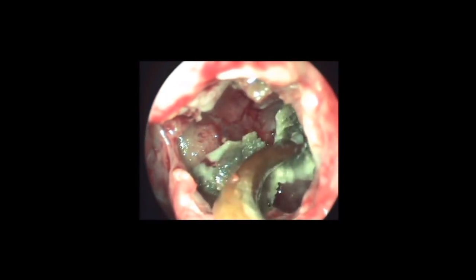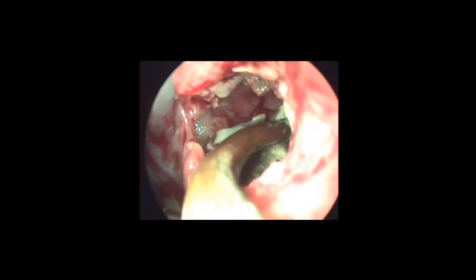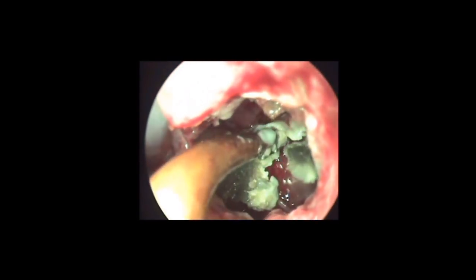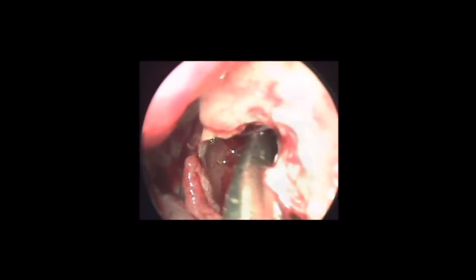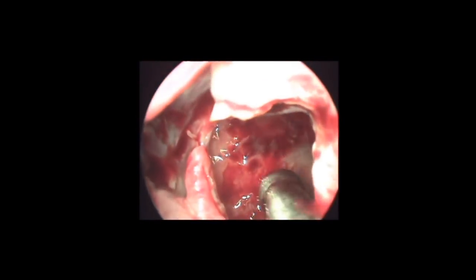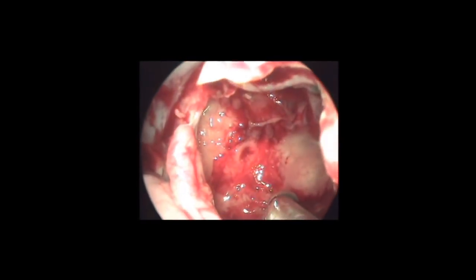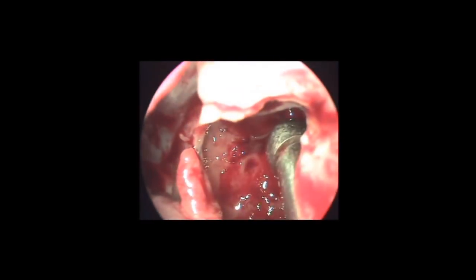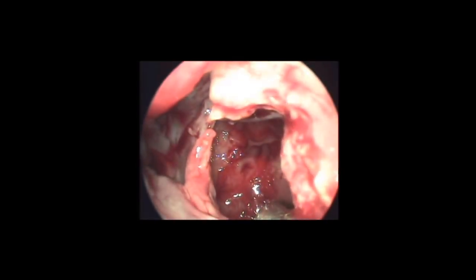The superior rim of the ostium is left undisturbed. The procedure can be performed under local anesthesia with very minimal instrumentation. Mini-FESS has high success rates with a patent middle meatal antrostomy, negligible recurrences, and no morbidity such as synechiae, post-operative crusting, or orbital injury.